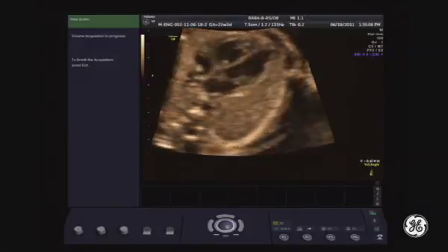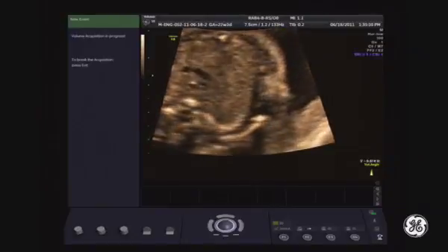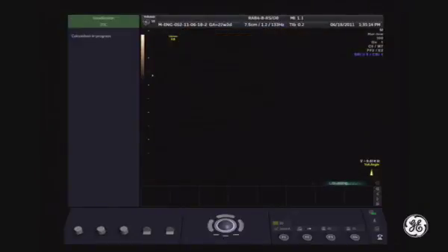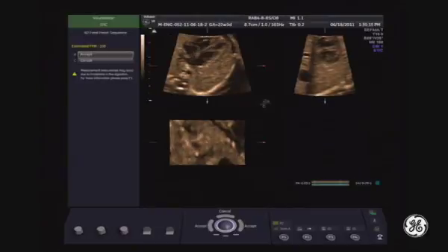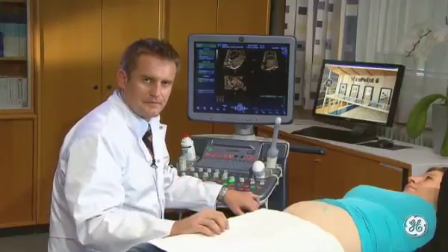Upper abdomen was there, 4-chamber, 5-chamber, and finally the upper mediastinum view. So looking at the preview, you can see the major sections that represent the cardiac views. Now we need to have a little introduction before we proceed further on.